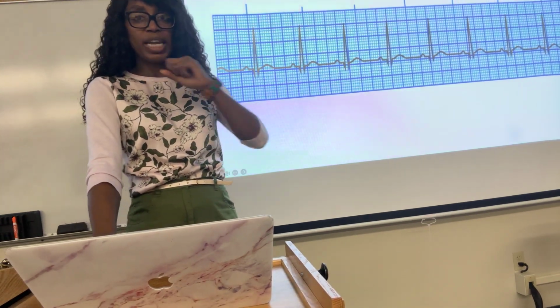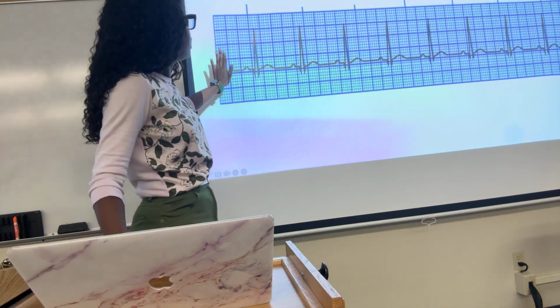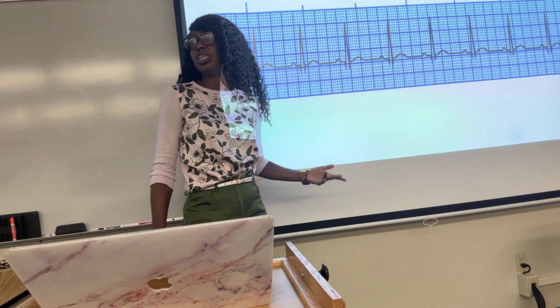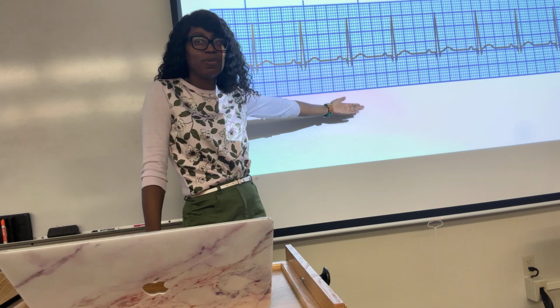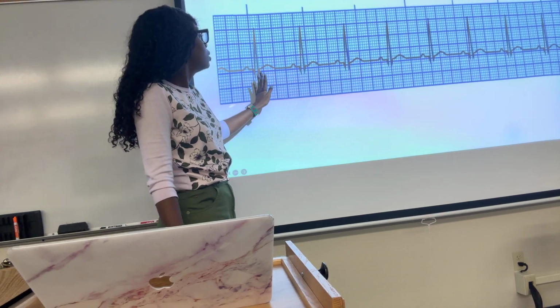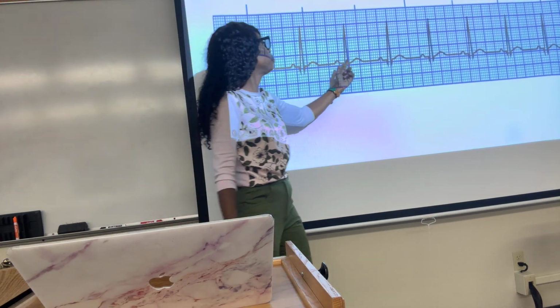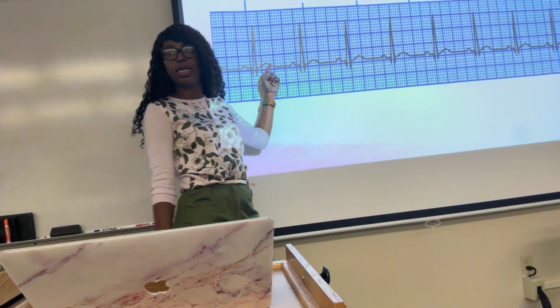So here's an example of regular, okay? And again, I have a few pictures here that show you the actual strip. No strip looks like this really. This is so perfect, right? So this is a normal QRS T wave, right? Atrial. Here's the P's. See them? Here's a QRS. See them? And here's a P. Here's a T wave.